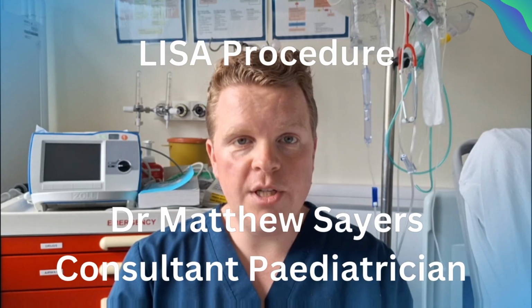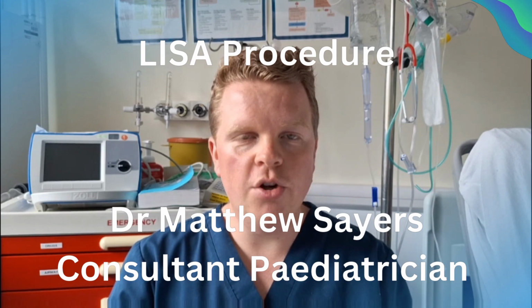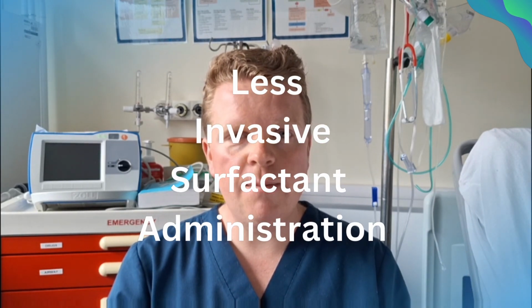LISA is not just a Simpsons character, it's an important neonatal procedure that is growing in importance all the time. LISA stands for Less Invasive Surfactant Administration, and it is the preferred way to administer surfactant to babies with respiratory distress syndrome that do not require mechanical ventilation.